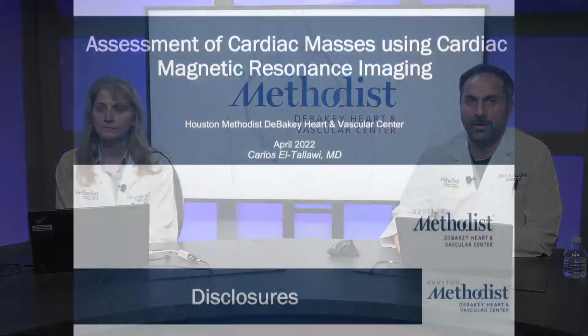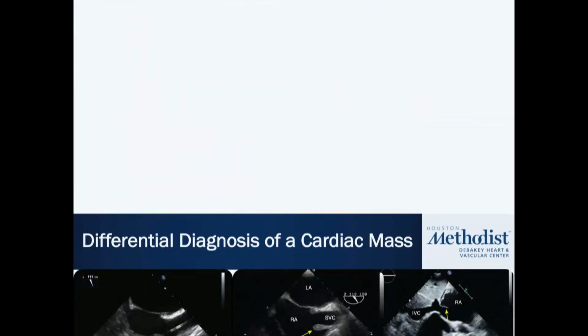So that was a beautiful lecture, and I don't know if you agree, but I think Dr. Kurrelmeyer made a good case as to why sometimes we need more advanced imaging to define a mass and assess its constitution essentially. So I'm going to talk about cardiac MRI. I have no disclosures for this talk.